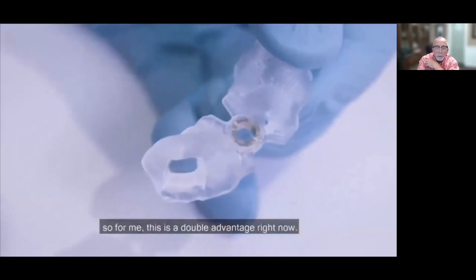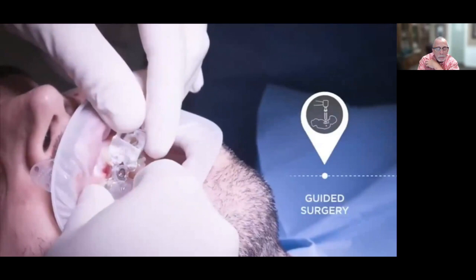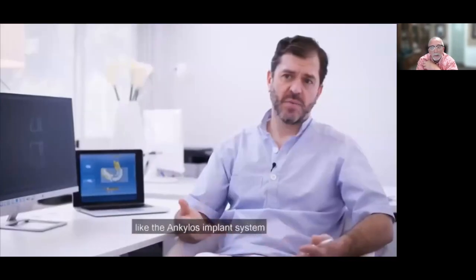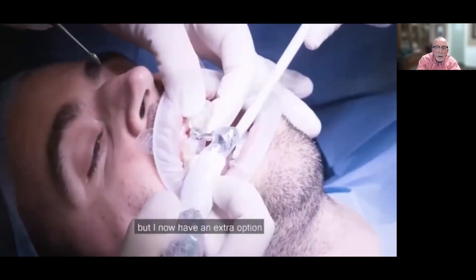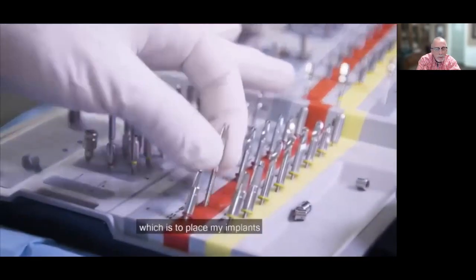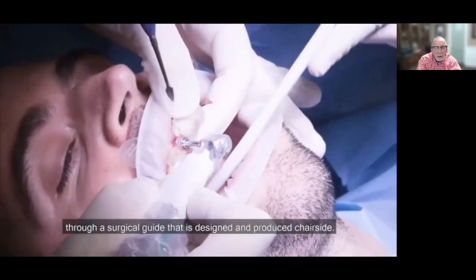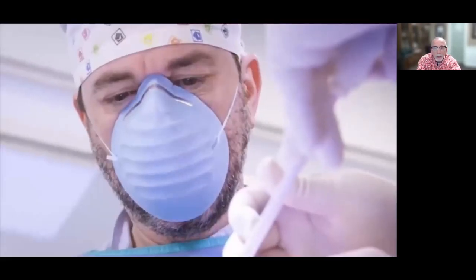The systems are also well structured with the data that we're putting in it, so it's all digitally integrated, right? And so it's kind of hard to mess this up. Now, I'm not saying you can go buy the stuff tomorrow and go do it tomorrow. You've got to have the training. But with the guides, even with a single tooth up front where you can feel and palpate the bone, you're not laying a flap. You might make a small incision and boom, you're placing that implant in a pretty short amount of time.